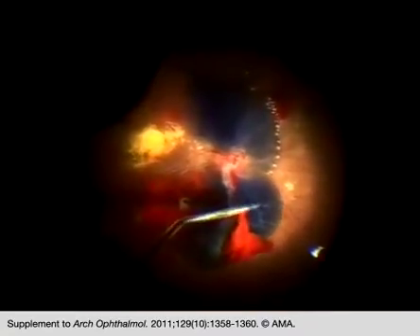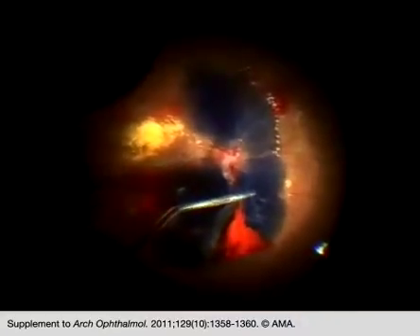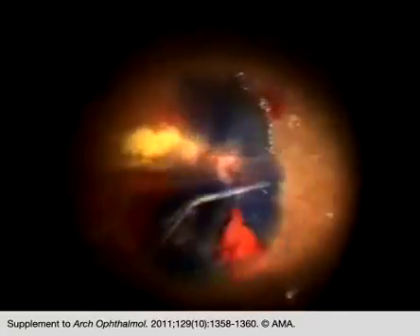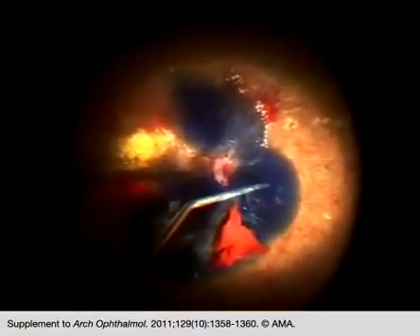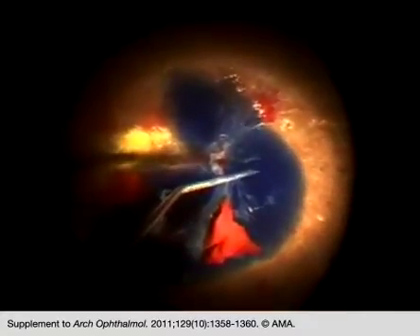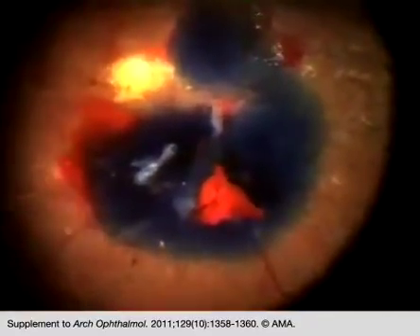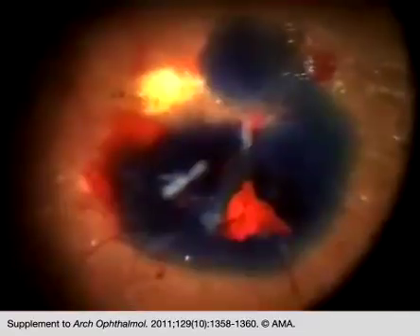By doing so, we know how much adhesion there is between the posterior hyaloid, the fibrovascular membranes, and the retina. Darker staining corresponds to areas where there is less adhesion, while lighter staining corresponds to areas with tighter adhesion.